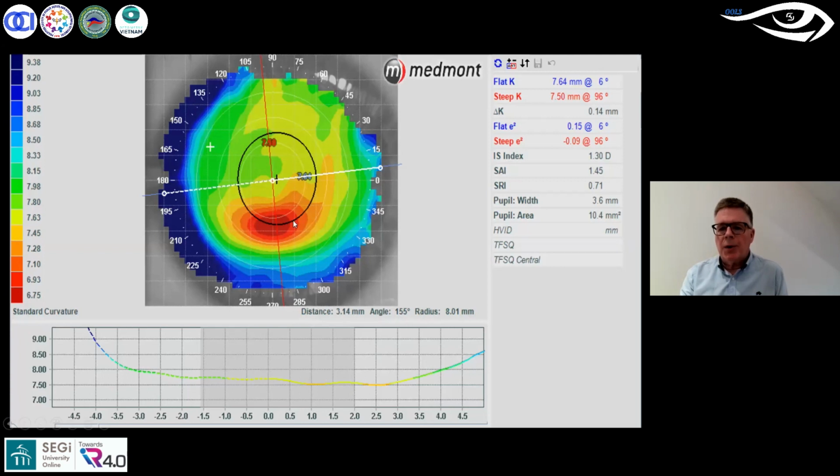You can see we've got a keratoconic patient here, but if we measure, we can see the edge of the cornea, we can see the limbus at this stage, we can see the limbus here. We've only got maybe 9 millimeters of coverage from these limited topographers. And I'm fully aware that there are more advanced instruments on the market now which can profile the cornea to limbus and well beyond. But this particular topographer allows us to take several images of the eye in different positions.